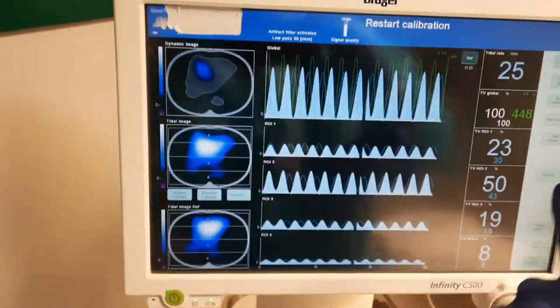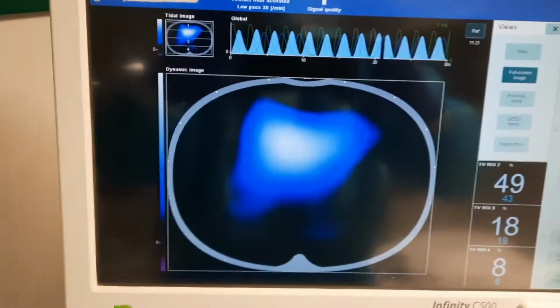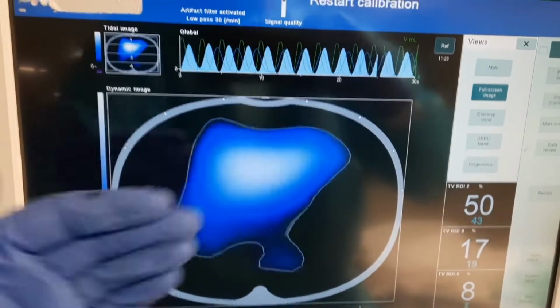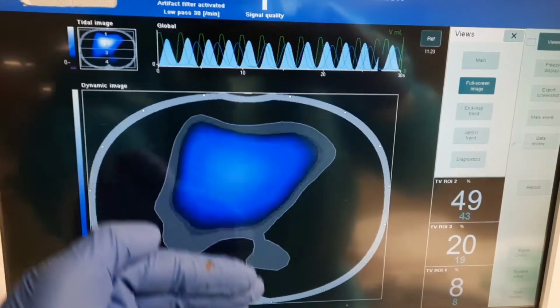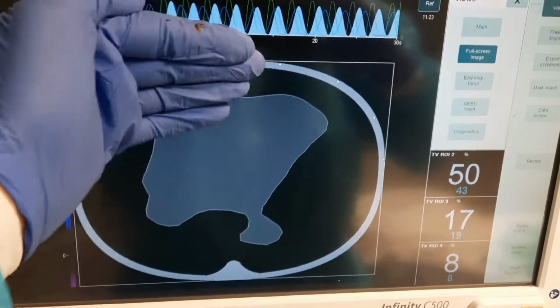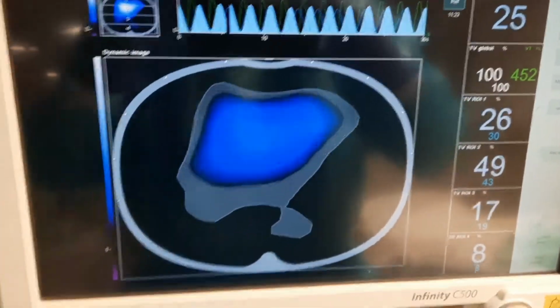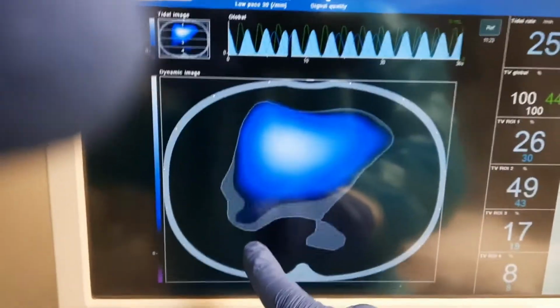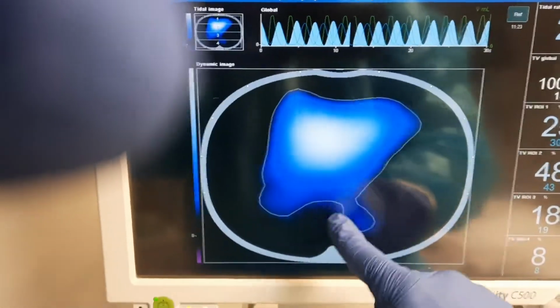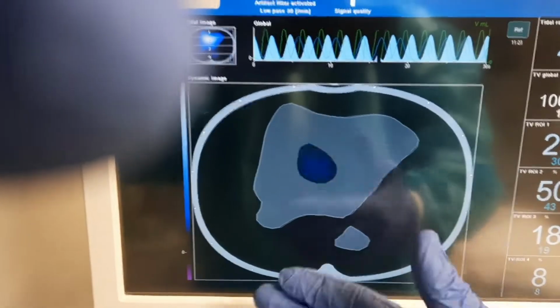We put the larger screen to get a perspective. So don't forget, this is a caudal to cranial view, right side, left side, sternum, vertebrae, ventral to dorsal, anterior, posterior. So similar perspective to CT scan. We realized that it says 8%, so when you're below 10%, this doesn't really appear blue, but it doesn't mean that there's zero ventilation. It's just that it's very minimal.